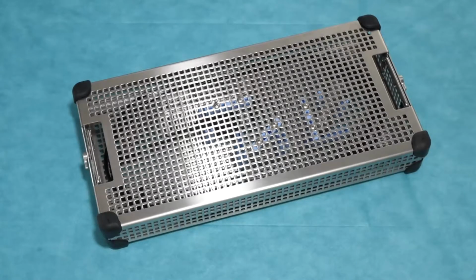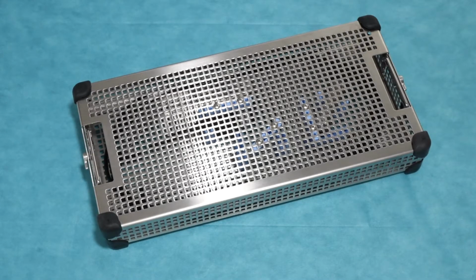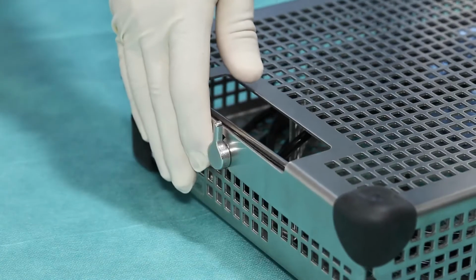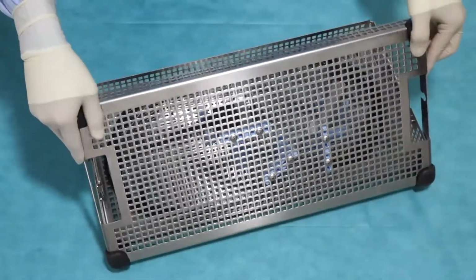It is quick and easy to take QEVO out of the tray. Open the tray by turning the side knobs upwards. Holding the device, take QEVO out of the tray.